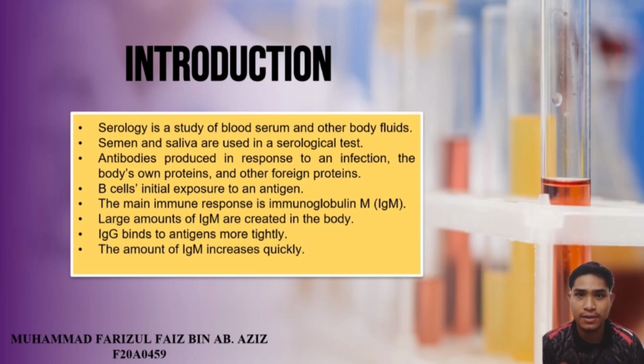Firstly, the scientific study of blood serum and other body fluid is known as serology. Serology is the diagnostic detection of antibodies in the serum according to immunological practice. Blood serum and bodily fluid like semen and saliva are used in serological tests.